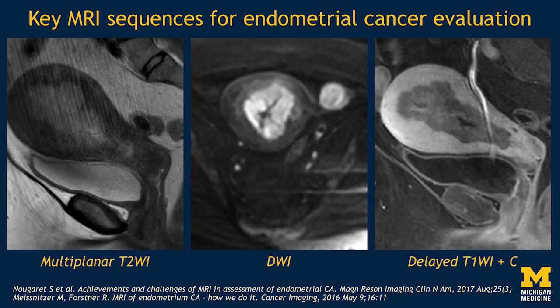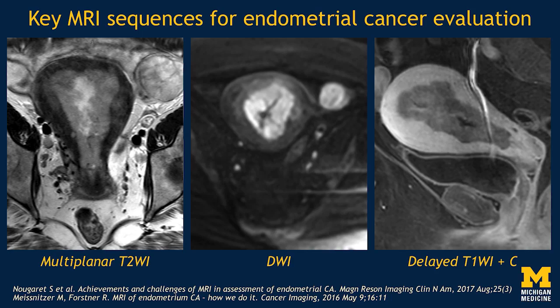The key MRI sequences for endometrial cancer evaluation are multiplanar T2, diffusion, and a dynamic or multiphasic post-contrast acquisition. On T2-weighted imaging, endometrial tumors are brighter than myometrium and darker than the normal endometrium. Here we see a little strip of normal endometrium in the middle on this axial image, and we see tumor out on both lateral margins — an intermediate gray that some people call 'evil gray.' That's the signal characteristic these masses will have on T2-weighted imaging.